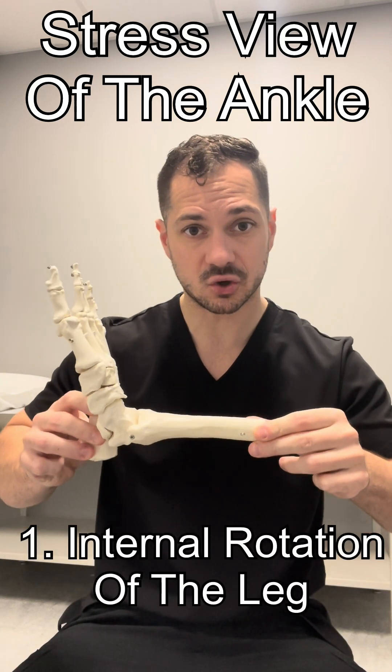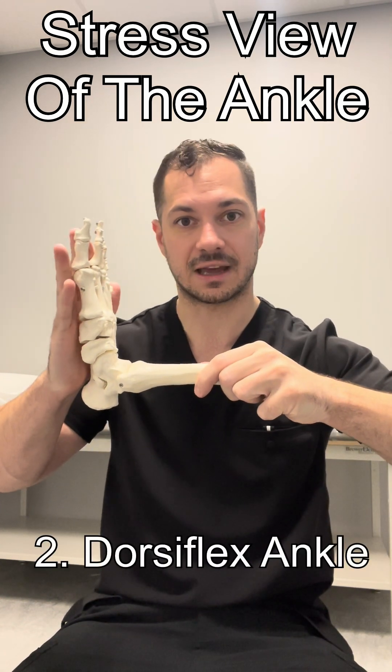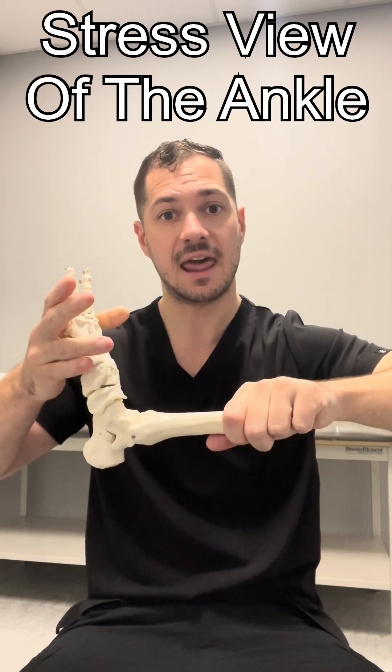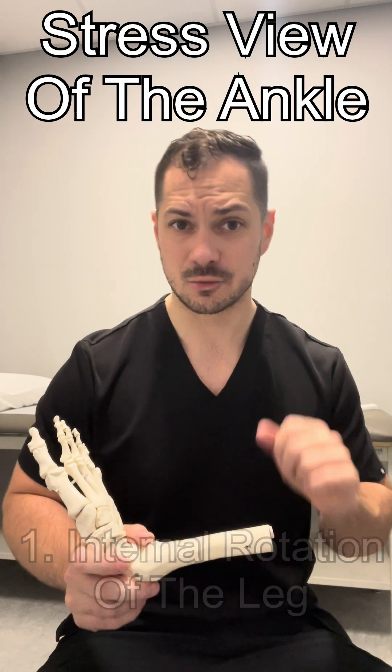The first step is to internally rotate the leg so the fibula and tibia are in the same plane as the board. From this position, we're going to dorsiflex the ankle. Then we're going to stabilize the patient's leg an inch or two below the knee. Next and final step is to externally rotate the patient's ankle, then shoot the film. Let's take you to the x-ray room and show you how we do it.